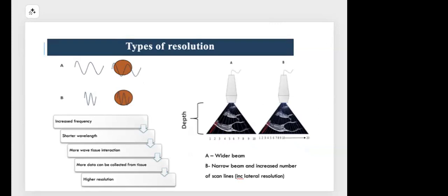from Dr. Pallav Singh. Can you explain? Okay, again temporal resolution. Yes, one question we have left from the start by Dr. Prashant Pandit. Can you explain something about mechanical index and how we can manage this for bubble contrast study?